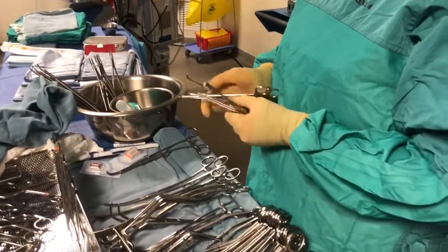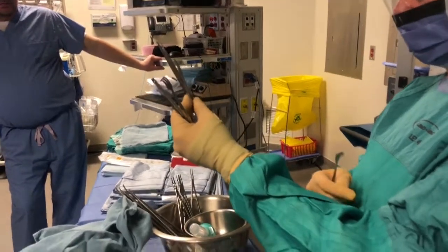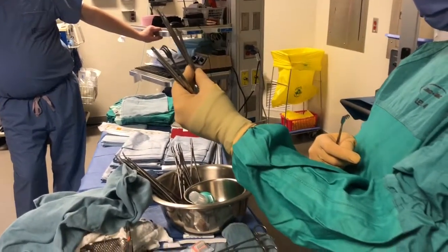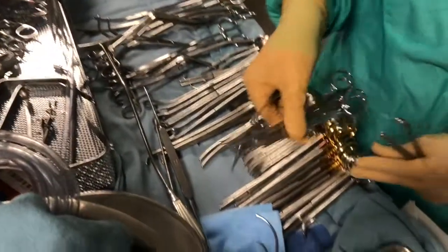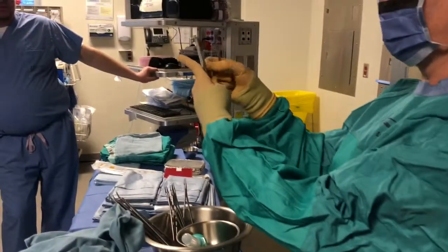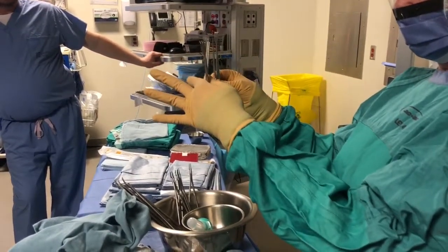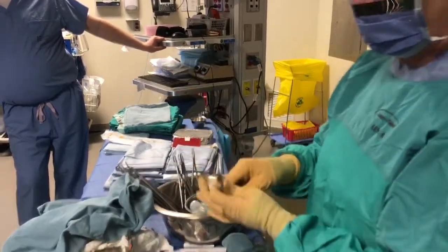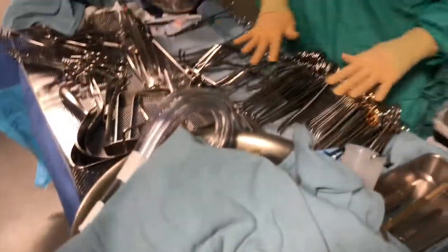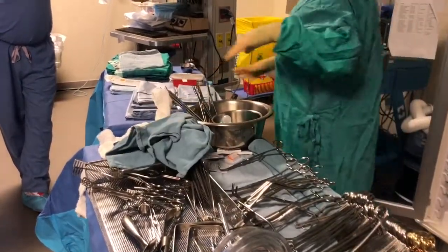1, 2, and 3 scissors. 1, 2, 3. Okay. And those are pots. And we're going to add 1, 2, 3, 4 retractors. Okay. So now I'm going to make sure that I got everything. Make sure there's nothing here.